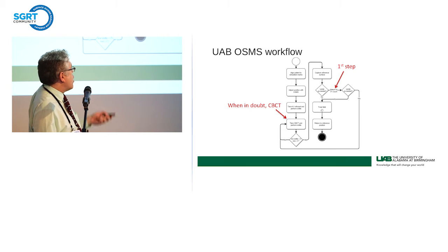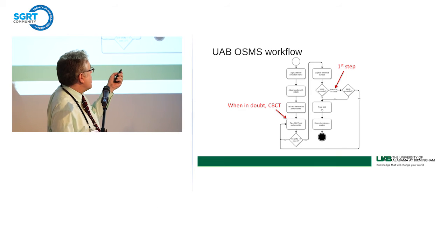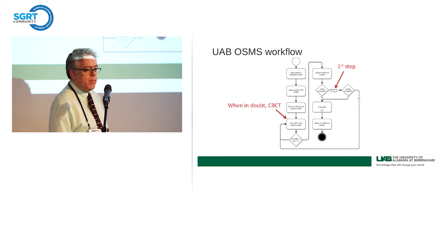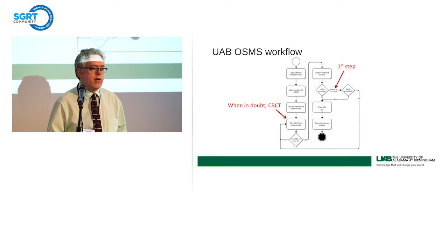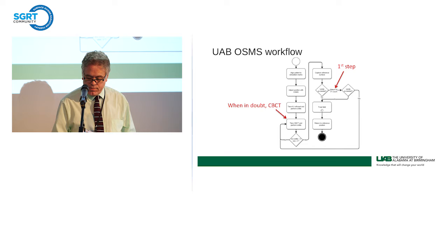So this is our first step, and then when in doubt, we cone beam CT. So whenever unsure, we go back to the gold standard for submillimetric SRS positioning.